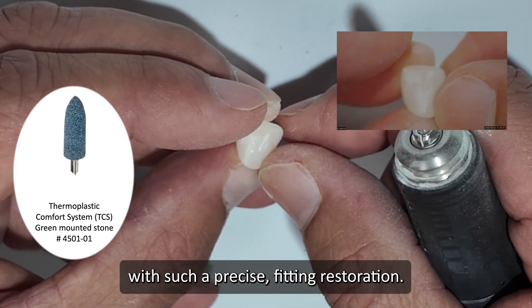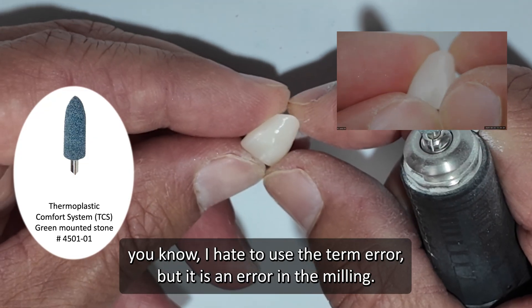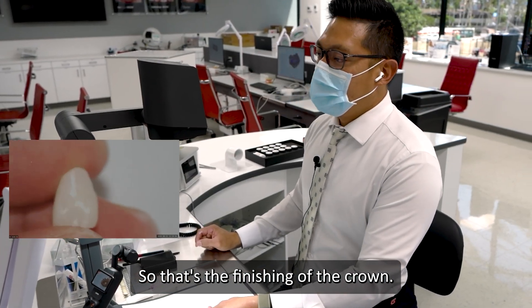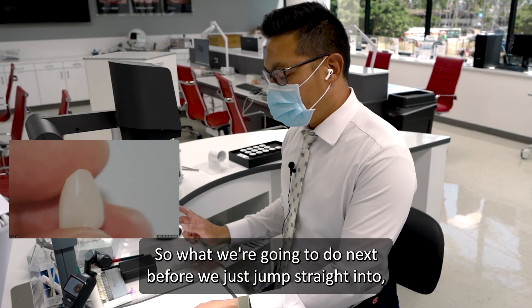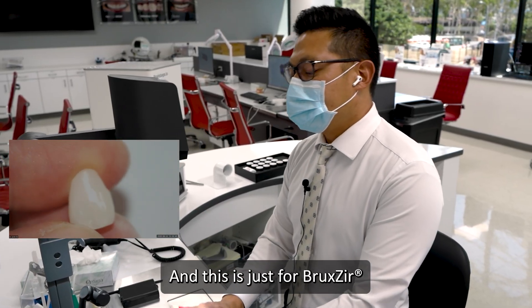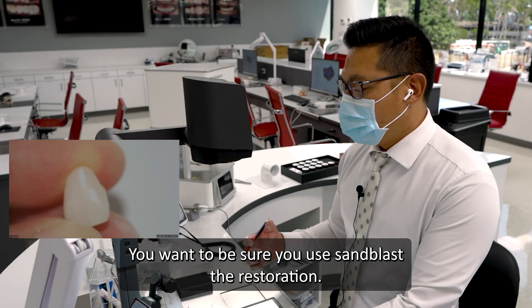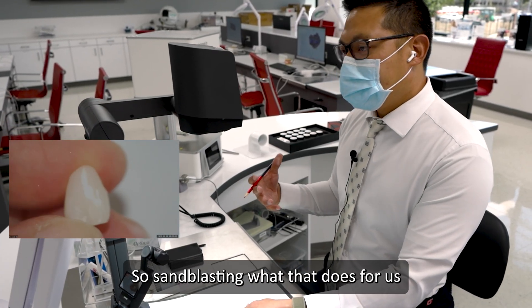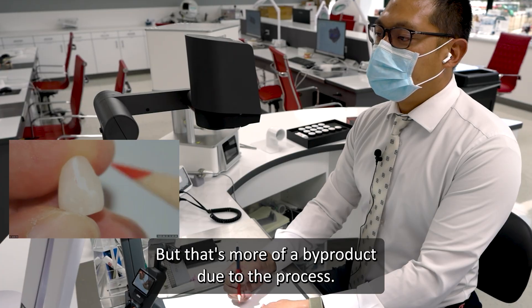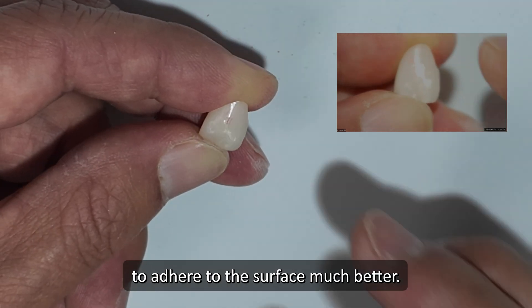It's amazing that we can end up with such a precise fitting restoration. It is just the natural engineering of these restorations. So that's the finishing of the crown. Before we jump straight into staining and glaze or applying our colors, we need to sandblast — and this is just for Bruxer. For Bruxer aesthetic, if you're finishing Bruxer on posterior, you want to be sure you sandblast the restoration. Sandblasting tones down the shine, but more importantly it roughens the surface, allowing the colors and the glaze to adhere to the surface much better.